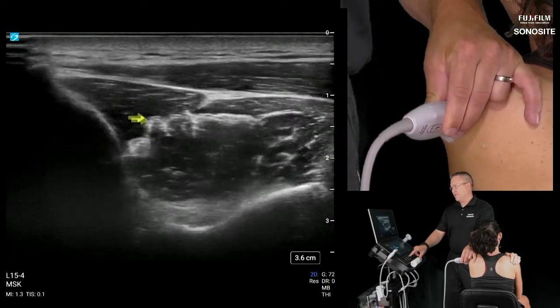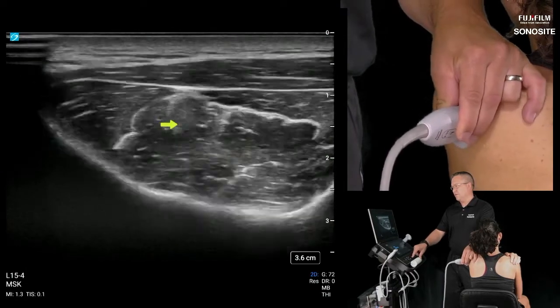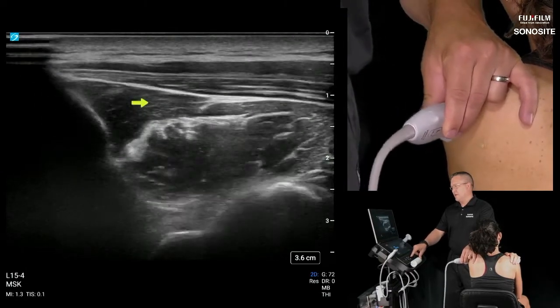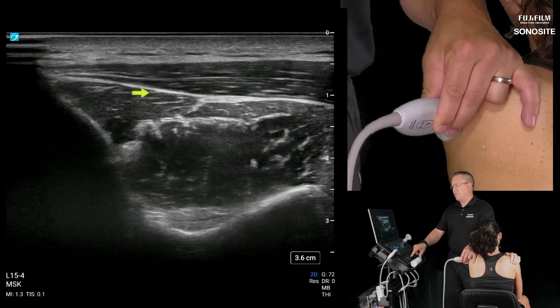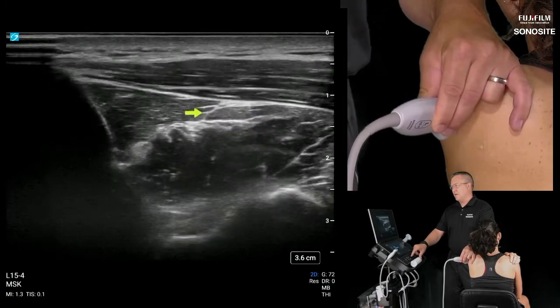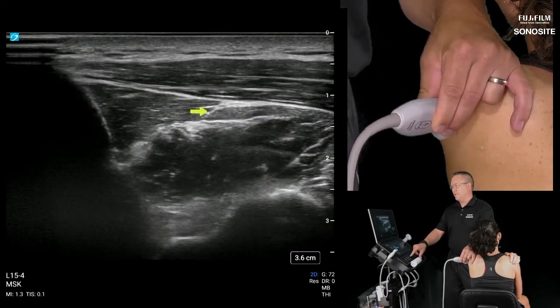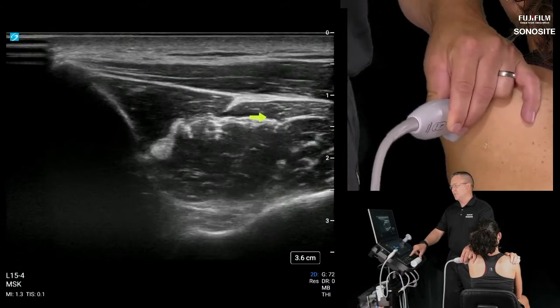And I'm looking for atrophy of either of these muscle heads, any of these three groups. I need to see hypoechoic muscle out to this outer rim of fascia around the muscle. I don't want to see a grainy, thickened appearance around the muscle that would indicate some sort of fatty atrophy. Same with the supraspinatus exam.